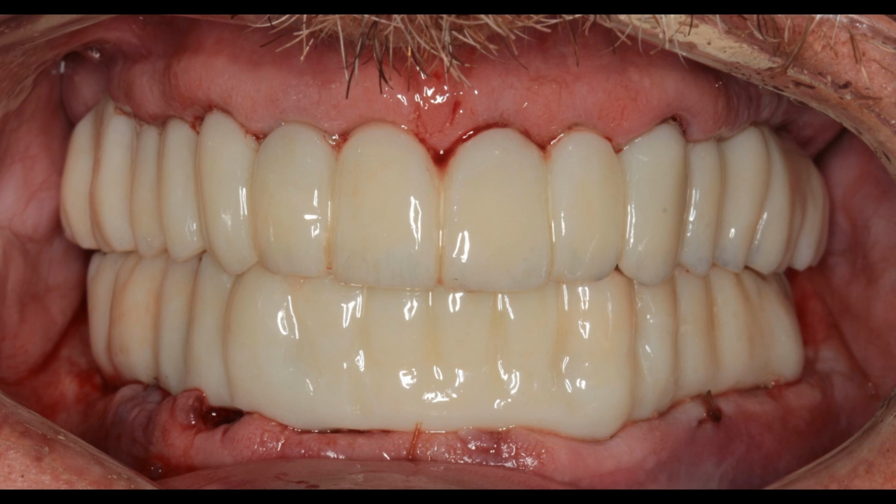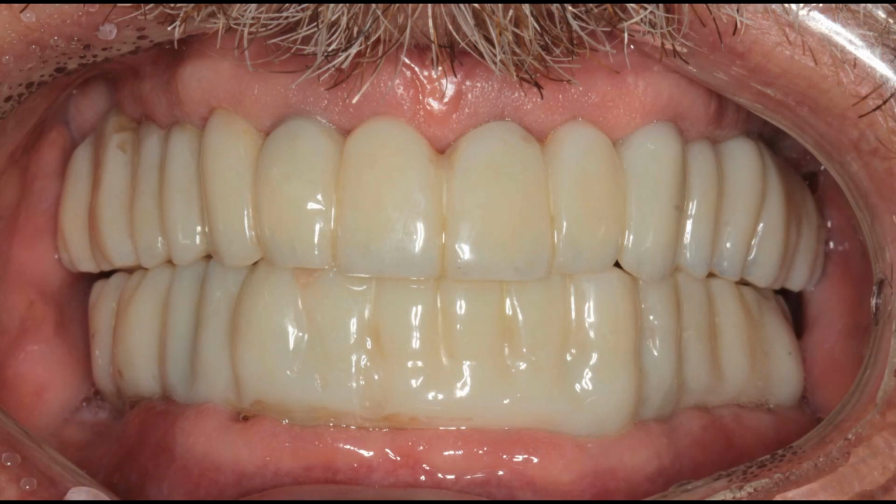Here are those upper and lower temporary restorations on the day of surgery. So he came in with those terrible teeth that you saw in the first slide and left with these beautiful temporaries. It took us about 8 hours. Here's the way the tissues look 3 months later. As you can see, only minimal shrinkage has happened over the 3 months that he was healing.